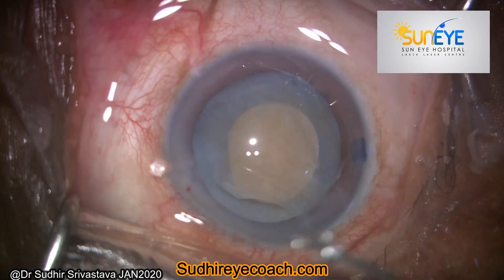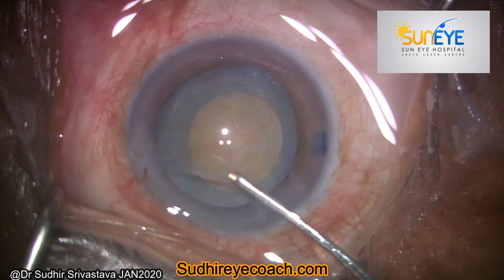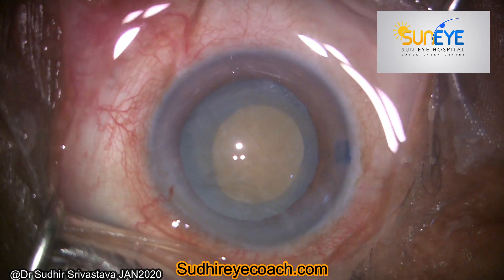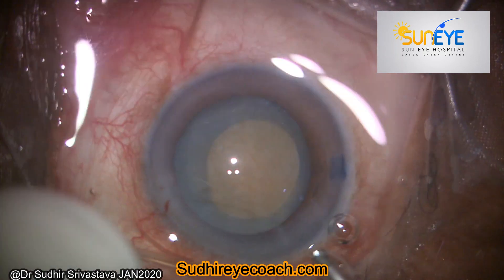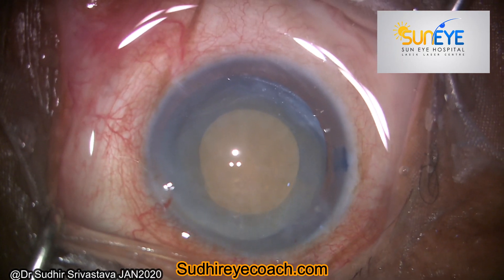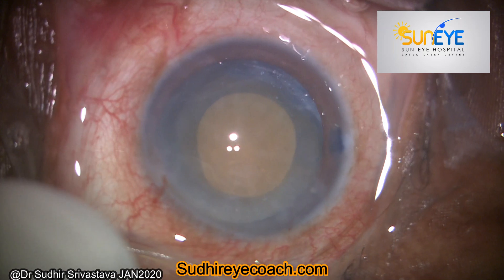Since all cortical matter has become liquid, the nucleus has become free and started rotating freely in the bag. It is a fact that the zonular/suspensory ligaments become weaker in hypermature cataracts, so you have to be very cautious and all your maneuvers must be gentle and controlled.